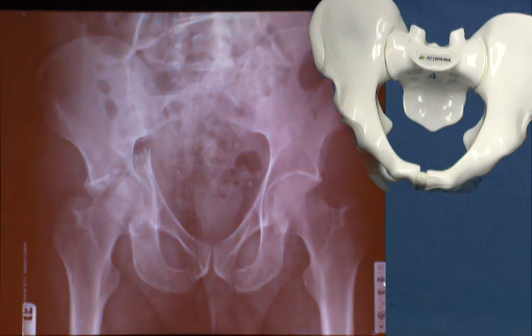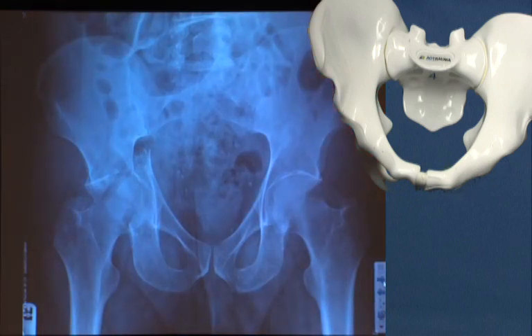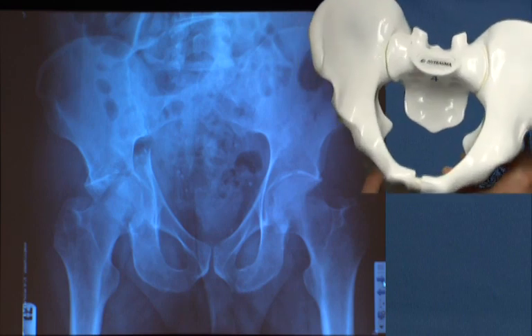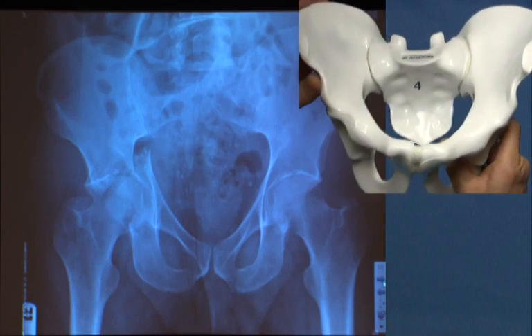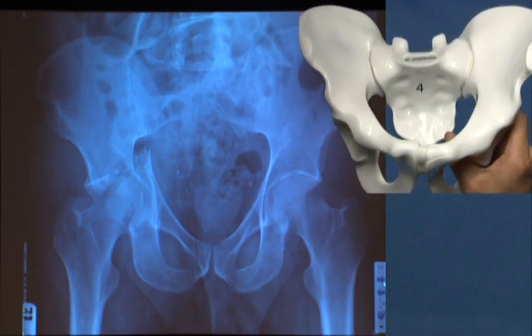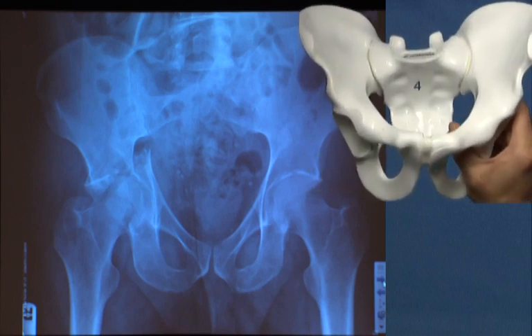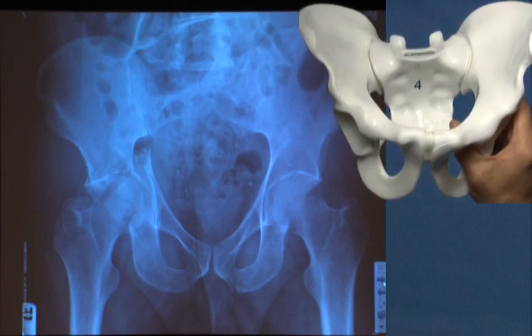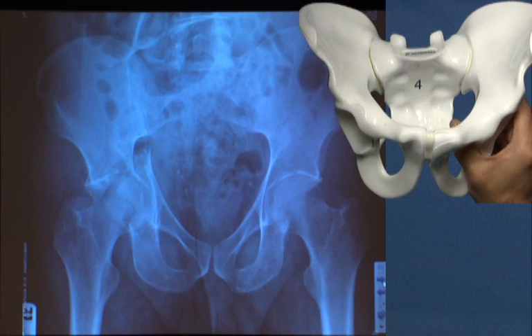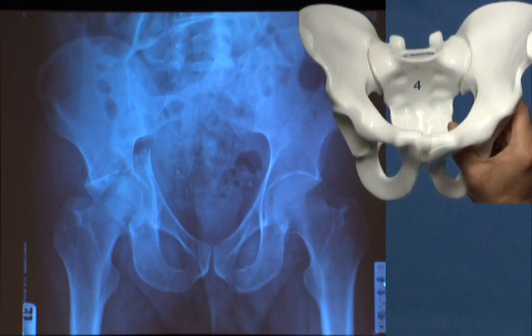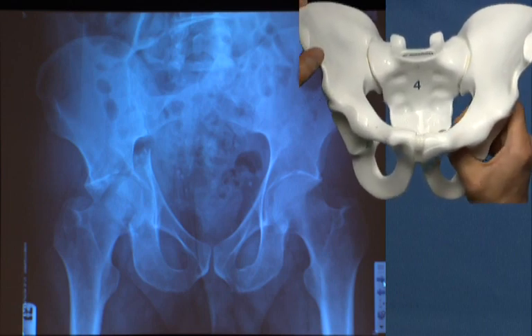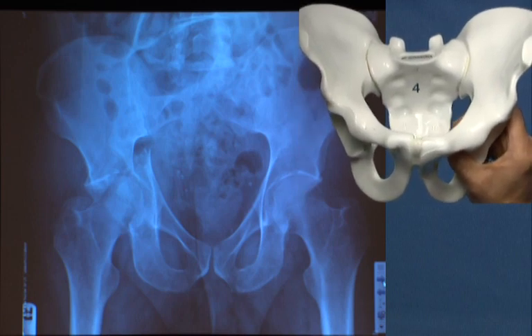It's not a big stretch to say that if you don't understand the anatomy of the fracture, you're unlikely to be able to effectively and accurately reduce it. That's why this is such a critical exercise. So we're going to introduce you now to preoperative planning — templating or drawing out a fracture on an intact model from our displaced X-rays. We're going to look at the AP pelvis radiograph and initially begin by translating the disruptions of our radiographic lines. We have 6 radiographic lines of Judet that we look at on the AP pelvis and we're going to translate those to our dry erase pelvis.